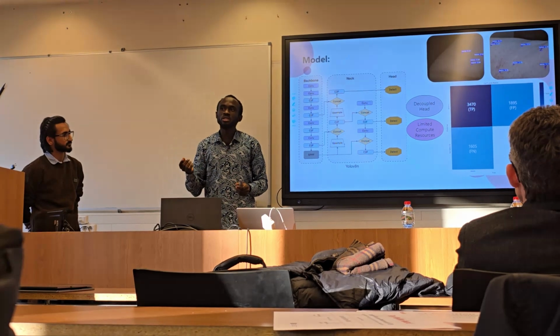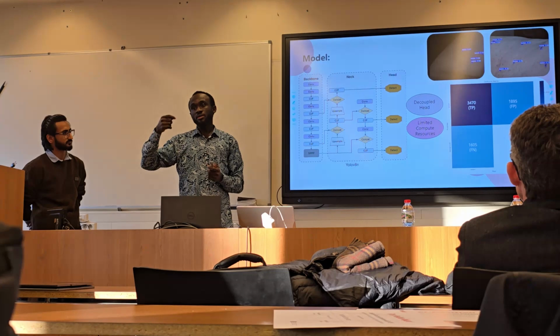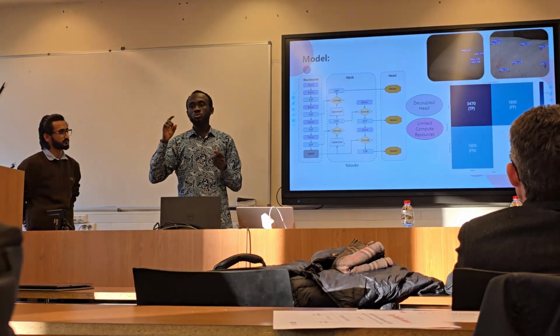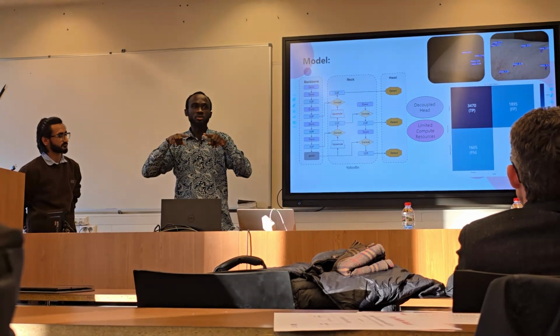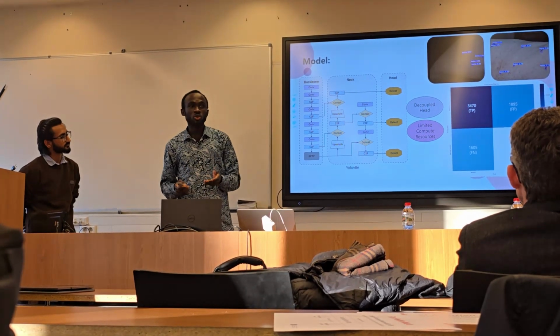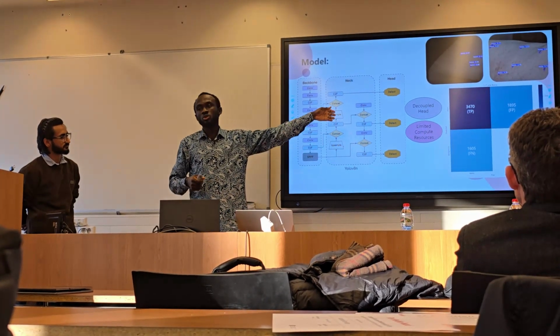So what we did was to work on the box loss and vary it to get YOLO to be able to detect those lesions that do not contain the bounding box. Then we trained the model, and these are the results from the confusion matrix.